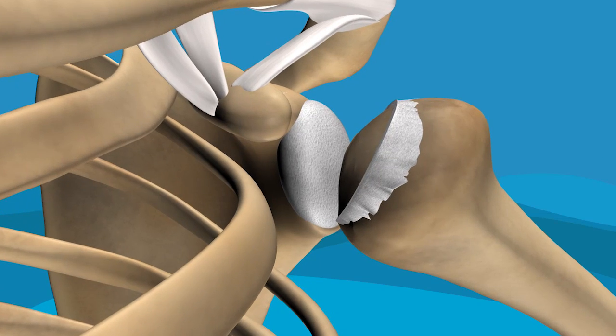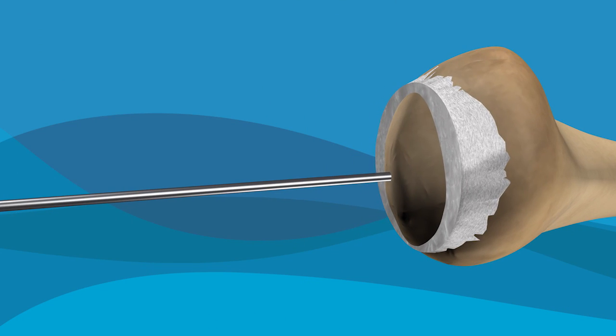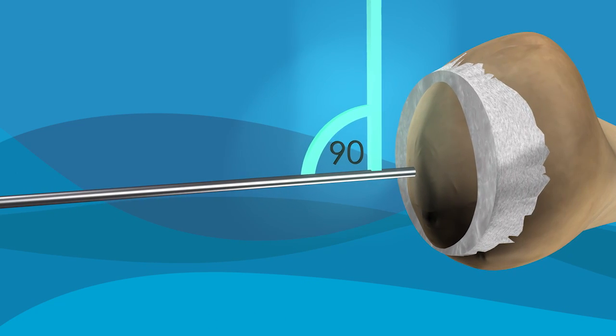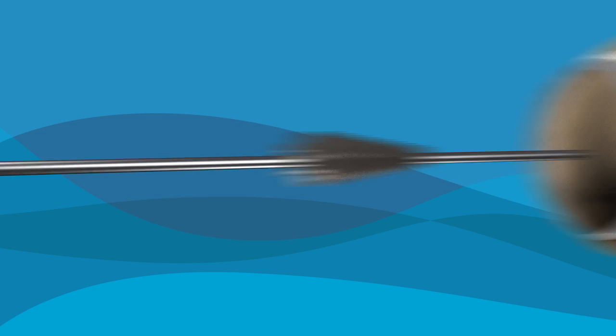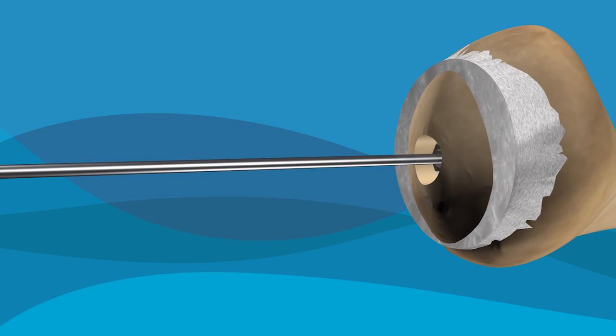First, your surgeon will insert a metal guide wire, ensuring that the implant itself will be placed at exactly the right angle. Next, the surgeon puts in a tapered screw designed for maximum strength, durability, and fixation.